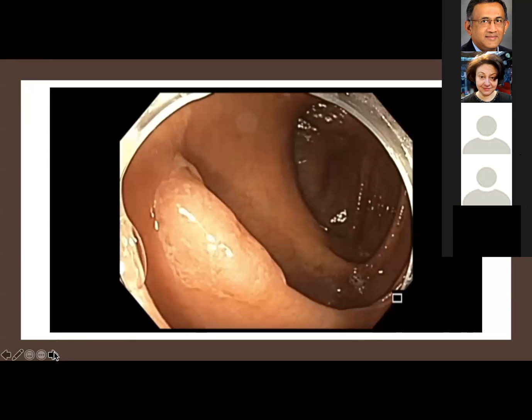Okay. But you need to get rid of the mucus and then see if there is any dysplastic features. Okay, I think that's good. So when you think about dysplastic features by looking at a lesion, when would you think that this is not a simple, straightforward SSA, but it is SSA with dysplasia? When would you think about that? What features?